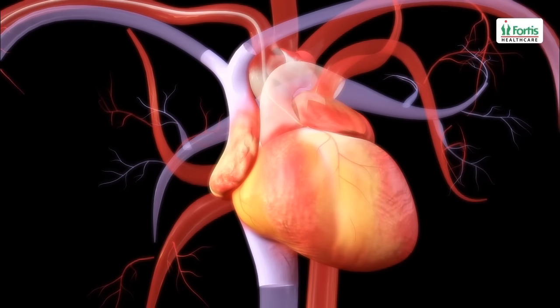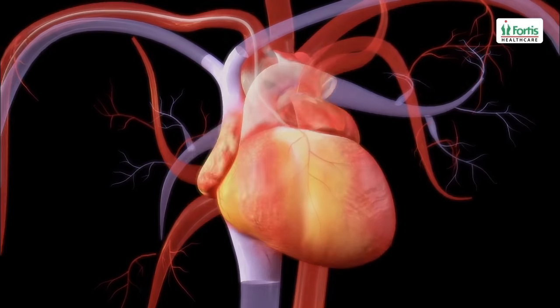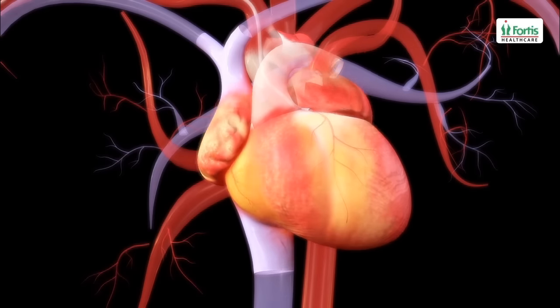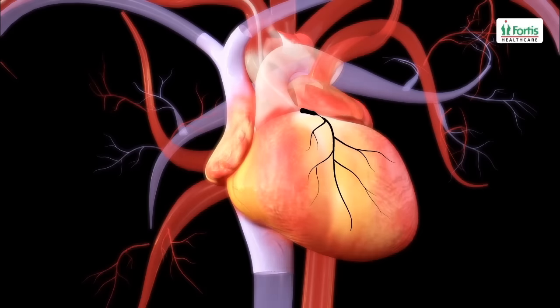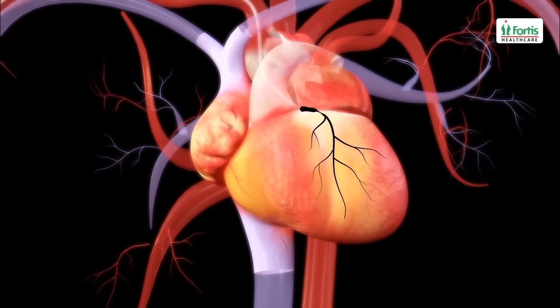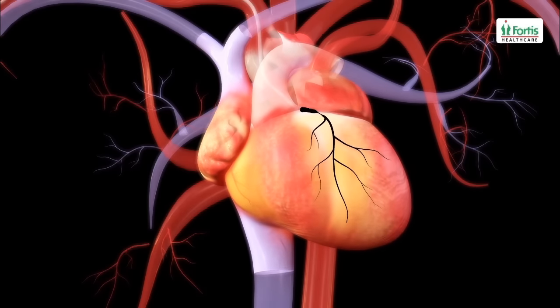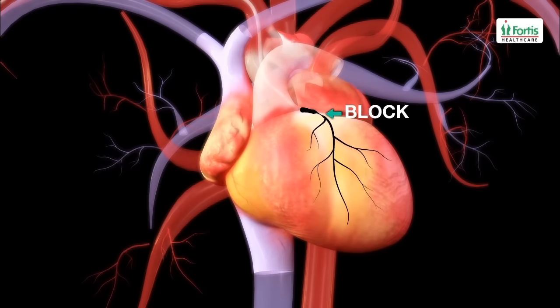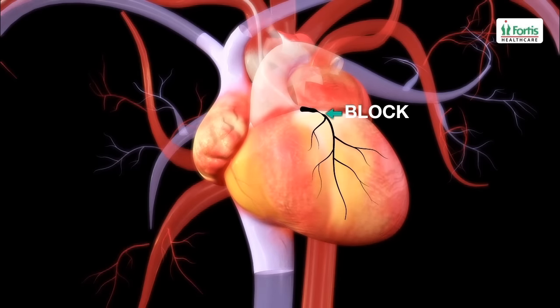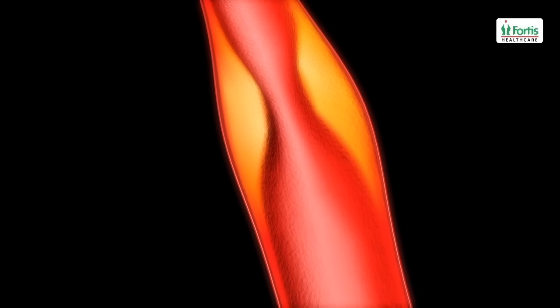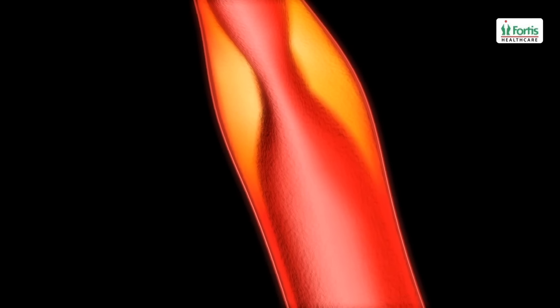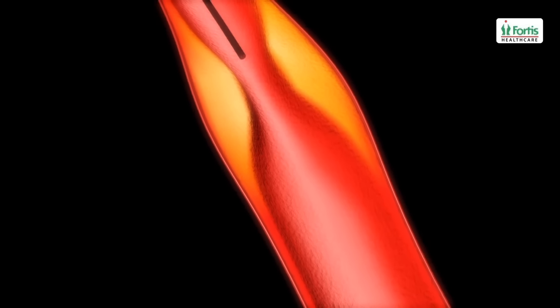The guide wire is removed and the tip of the catheter is positioned to enter the coronary artery. A special dye is injected which allows the fluoroscope to take X-ray images of the arterial interiors, helping to identify the position of the blockage. This imaging procedure is called an angiogram.